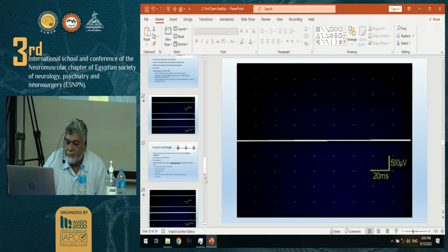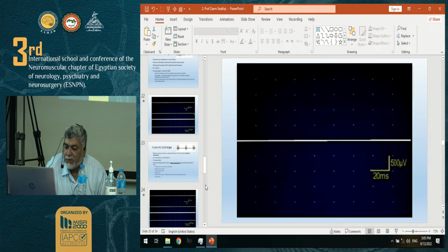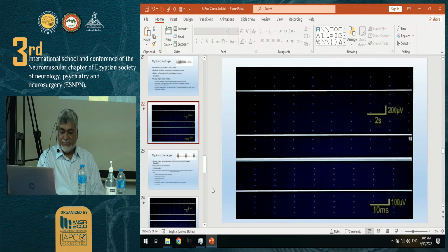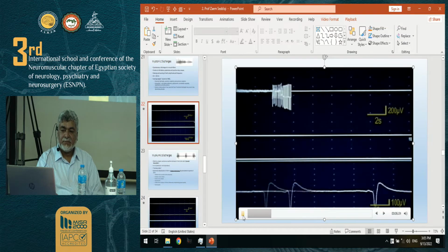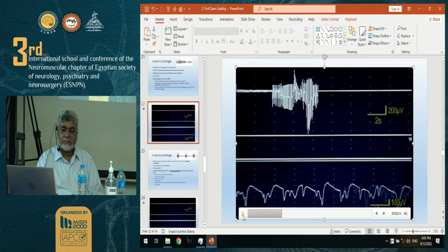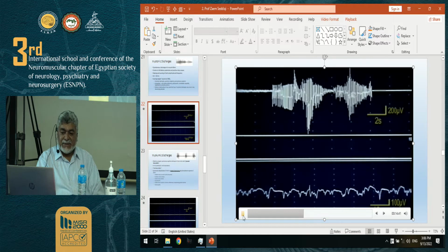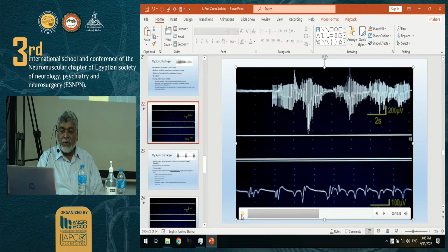Okay. What else? So complex. And let's talk about, somebody mentioned here. This one, somebody said it's a lot of fun to hear that. Here it is. Guys, do you need to look at the screen to recognize the sound? Don't look. Okay. So here it is. So it's coming from, look at what I wanted to show you.